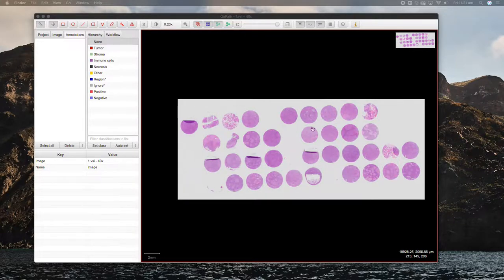I've got one of your TMAs loaded up at the moment. So a couple of ways that you can save out all of these individually. What I'm working on, and this is the assumption, is each of these cores you want to export as an individual core labeled with the coordinates, so A1, A2, A3, B2, B3, etc. If that's right, then we're all good. If it's not, let me know, and I'll have a look into what you need.